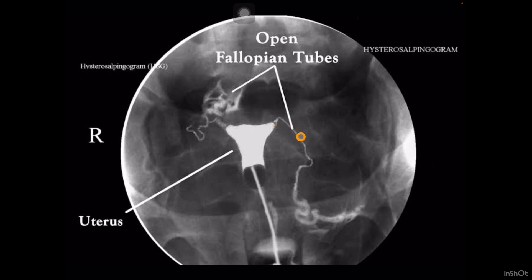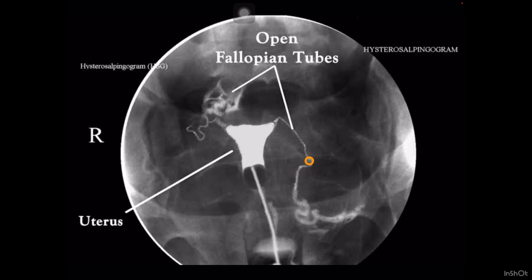Let's discuss the isthmus. The basic word meaning of isthmus is the narrow part. The narrow part of the fallopian tube is the isthmus. You can appreciate this is the isthmus part — it is basically a straight part. Very little tortuosity we can appreciate in the isthmus. The isthmus is very near to the uterus — it is the first part near the uterus and it is the straight part of the fallopian tube.